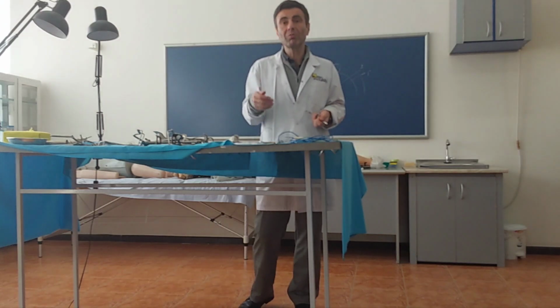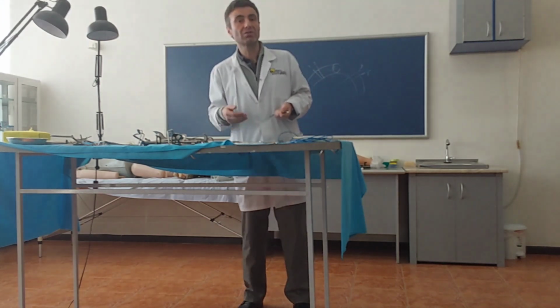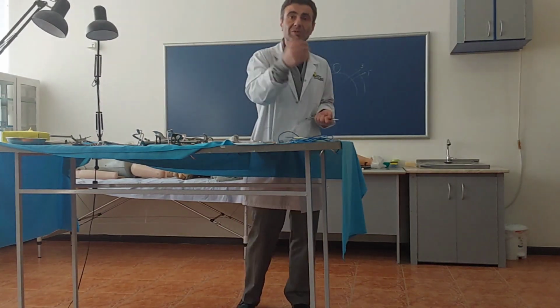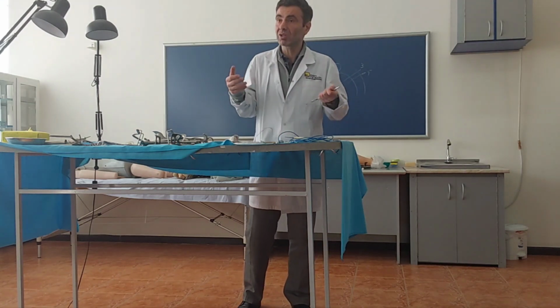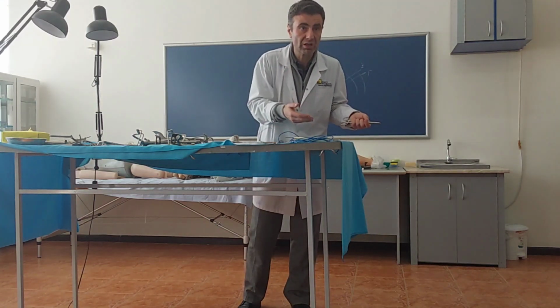Stapler is some equipment which makes metallical sutures between different structures. For example, metallical sutures of the vessels, metallical sutures of the intestine, metallical suture of the respiratory organs, skin. It's using non-organic wires. Like you use staplers to connect your papers to each other.